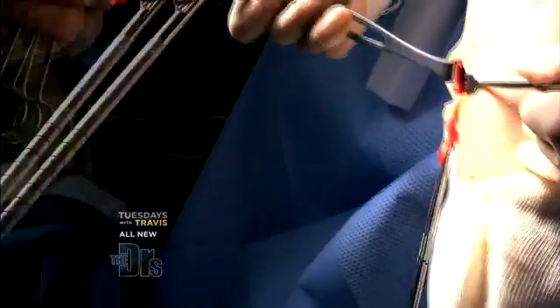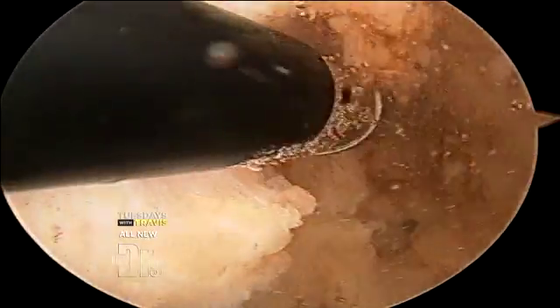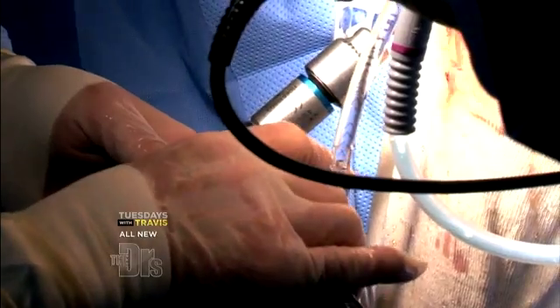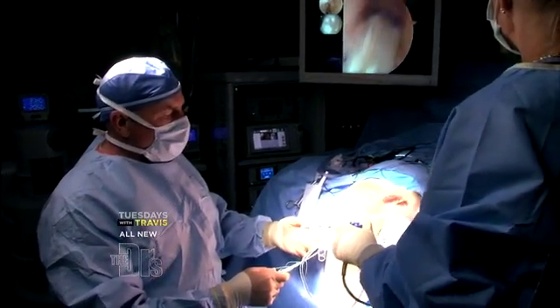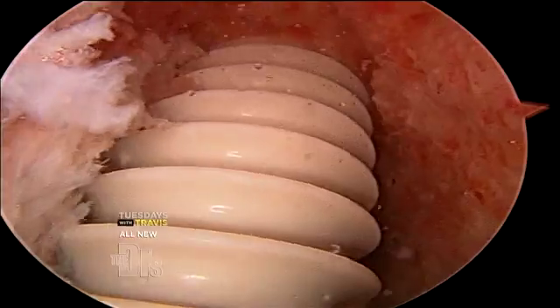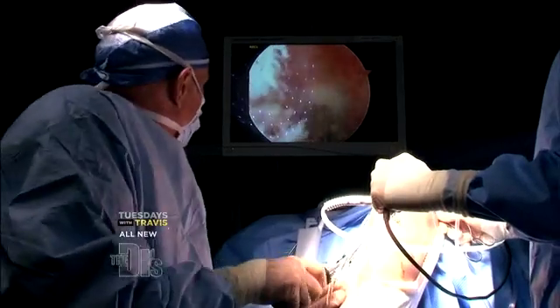These are the two tendons we're taking from the hamstring to replace Cody's ACL. Now we're in the back of the knee joint — here is what the remnant of the ACL is. This reamer will create a tunnel the same size as our graft. We've passed the graft up through the tibial tunnel into the femoral tunnel. Now we're going to put in interference screws, which allows the tendon to heal to the bone and become a new ligament.